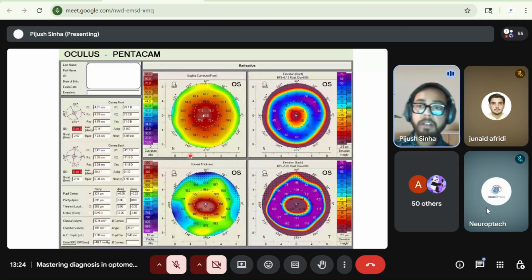Even so, in many patients I have seen with scleral contact lenses, the vision gets improved. But in this kind of patient, corneal transplantation can be a good option. That is optical penetrating keratoplasty. And here you see these two are showing isolated islands. So what I told you, an isolated island tells you it is a localized cone. Okay, and here also the corneal thickness is very thin.